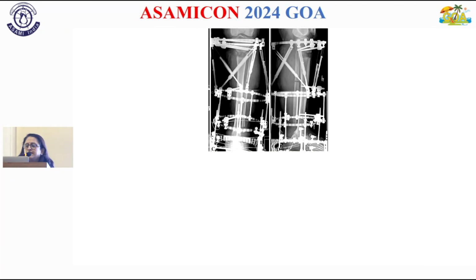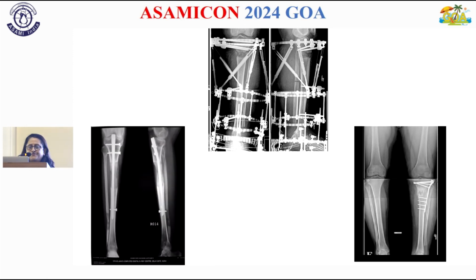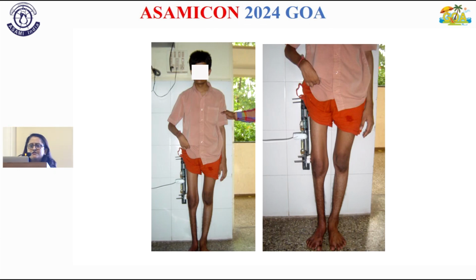Then came lengthening first and nailing, and lengthening first and plating. And the latest player in this field is, of course, the self-lengthening, completely implantable nail. A few words about lengthening over nail.